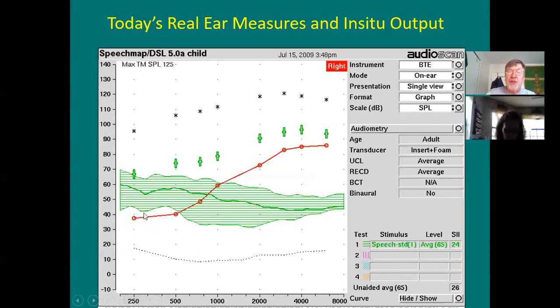So the threshold that you're seeing here for the right ear is the thresholds you obtained under headphones, and then you're adding minimal audible pressure to it to get these thresholds in dB SPL rising up as you go to the right. So your thresholds in dB HL plus your minimal audible pressure at the bottom here equals your thresholds in dB SPL. Now, I'll say that a third time so that when I put that on the final, everybody's going to get that correct, okay?